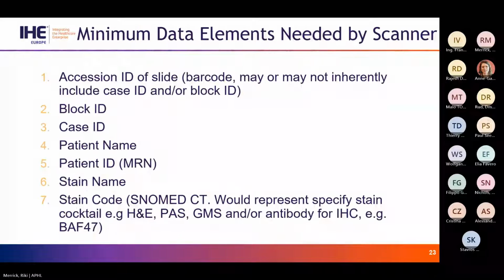Next slide. So here's the minimum data elements, expanded slightly, that we focused on. Some things are pretty straightforward. One of the ones that was a little bit more complicated, so I would say we left it for phase 2 and we're working on this change proposal now, is how best to represent the stain that's there.